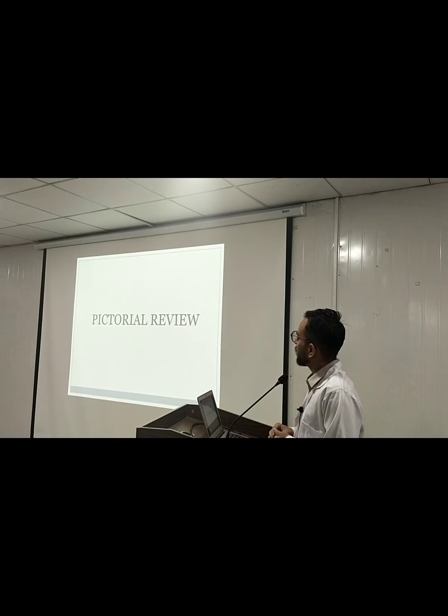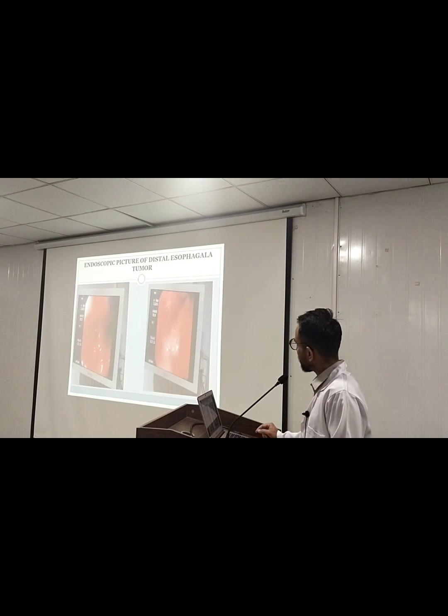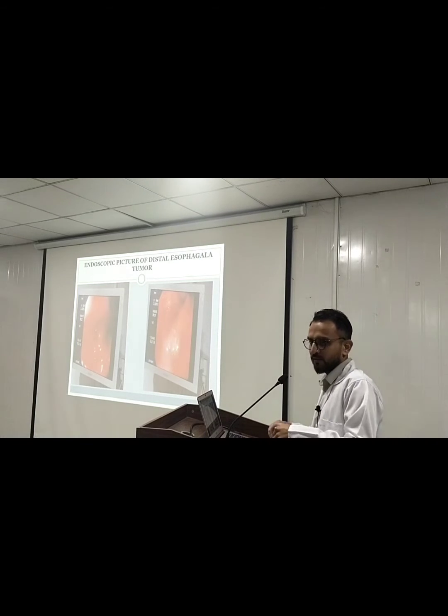So here we have the pictorial review of a patient whose endoscopies were done, and that was used for diagnostic and therapeutic purposes. The first one is an endoscopic picture of a distal esophageal tumor. Dr. Shan will explain some of the.